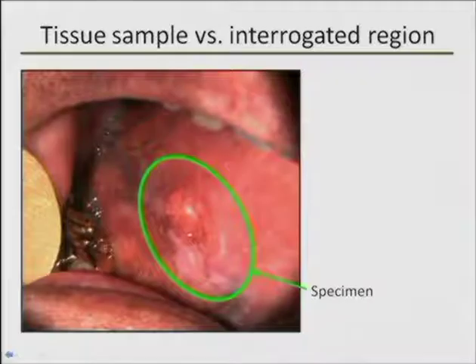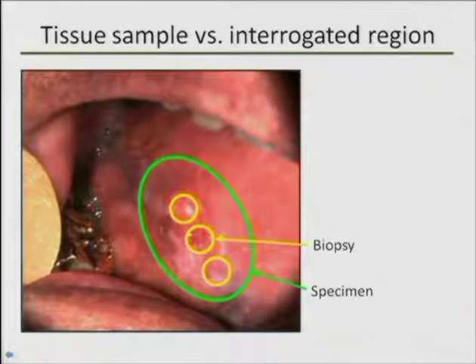But let's suppose that you have a few biopsies that were taken within the specimen at particular measurement sites. Say, for example, these 3 biopsies here, and there is no reason why those biopsies would necessarily have the same histopathology diagnosis as each other or as the overall specimen.